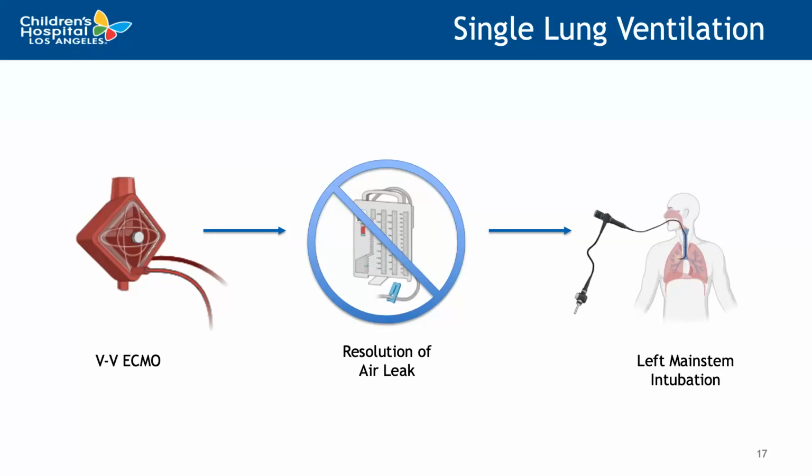And so again, the question continued to be, would the collapsed lung tissue be recruitable, or was this purely necrotic lung tissue? But the only way to figure that out was allowing ample time for resolution. And it was not felt that he would be amenable to reduction of those pneumatoceles with a surgical procedure.